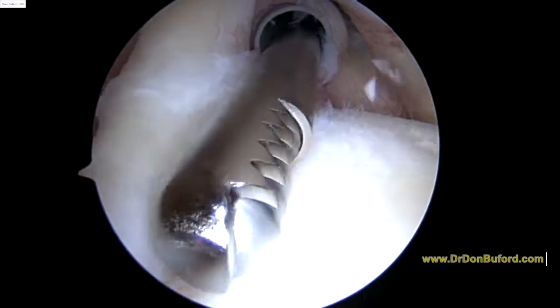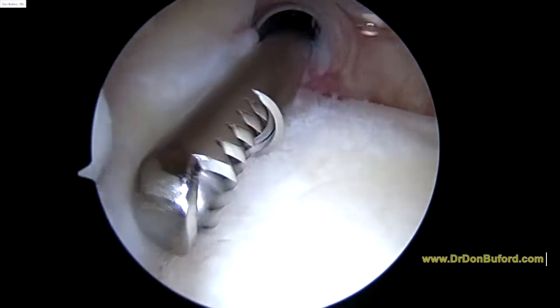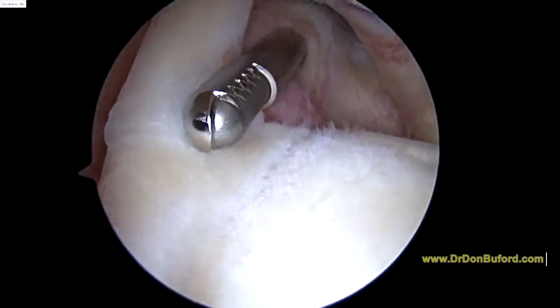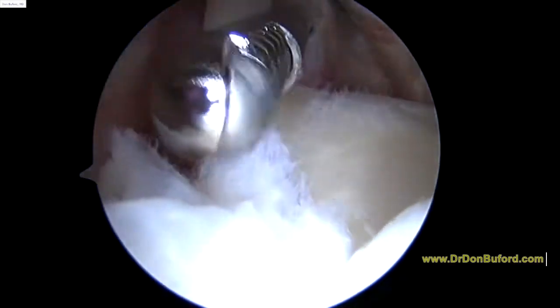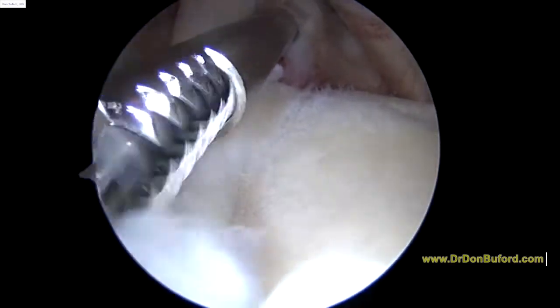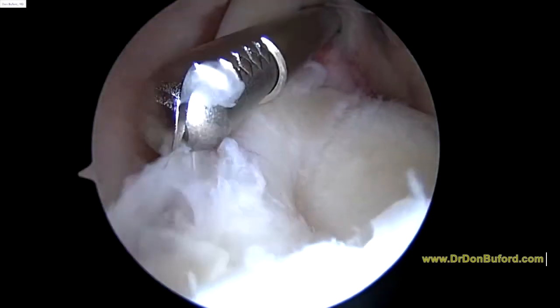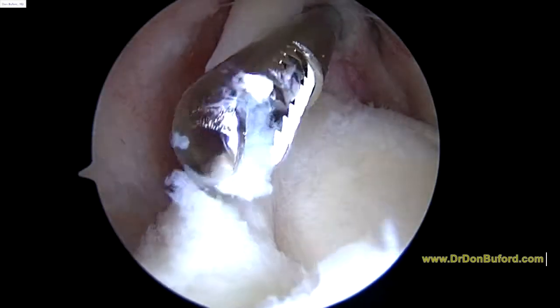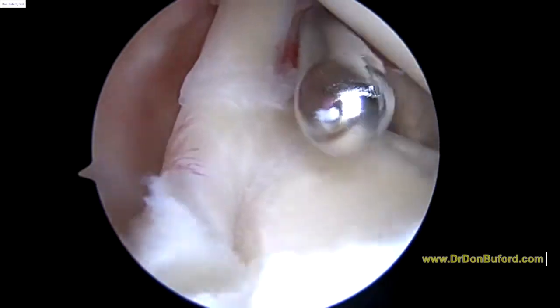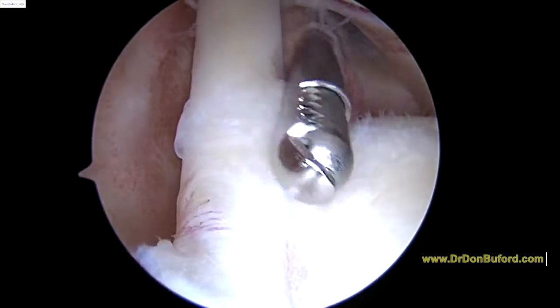We're going to smooth that out a little bit to make sure it's not a more significant attachment. This type of what we call a SLAP lesion happens with normal wear and tear changes in the shoulder. There are a couple choices we have if we believe that's the source of pain.